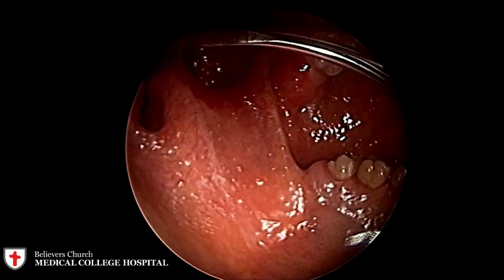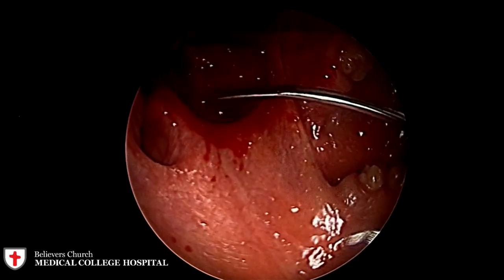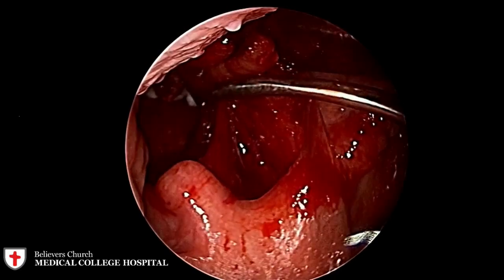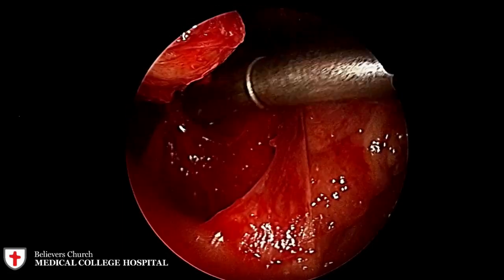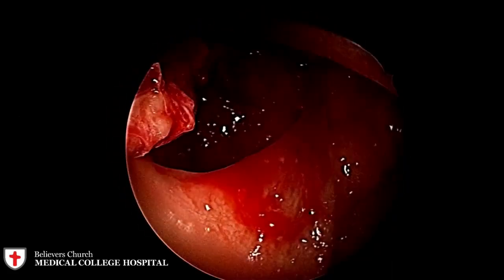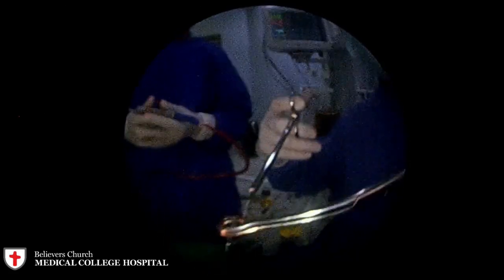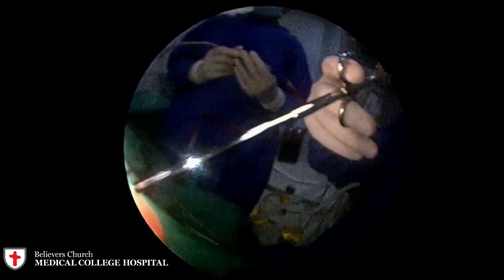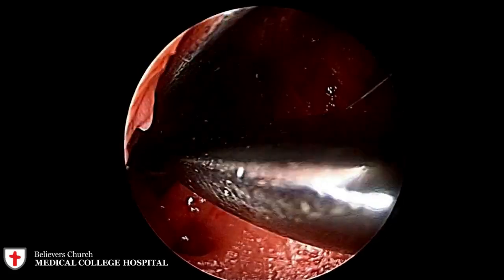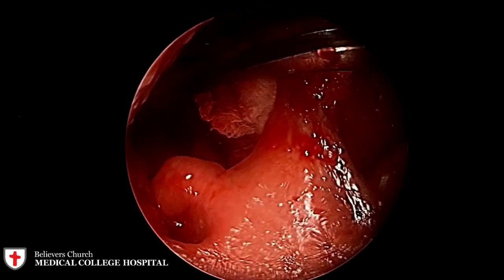The dissection is carried out from the superior pole all the way down to the inferior pole. After reaching the inferior pole, we use Eve's tonsillar snare. The tonsil holding forceps is taken out and the snare is placed over the tonsil to crush and cut the inferior pole. Once the tonsil is removed, the fossa is packed with gauze to allow time for hemostasis.